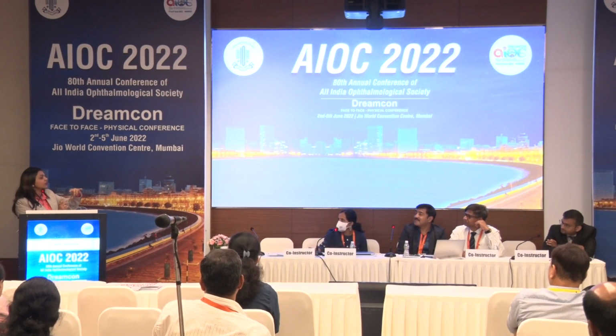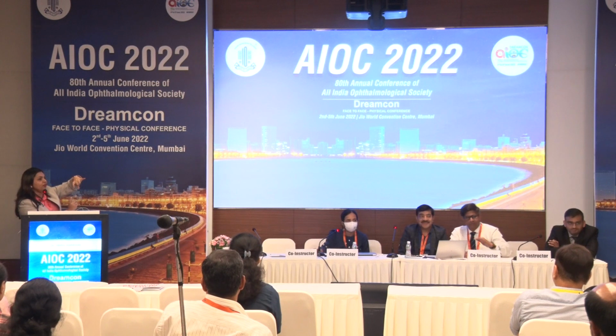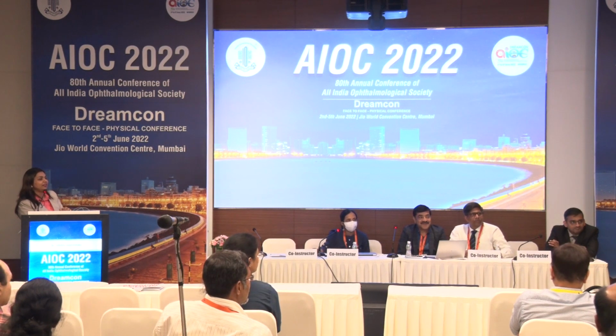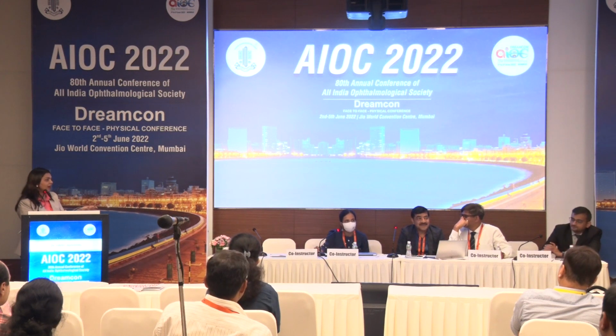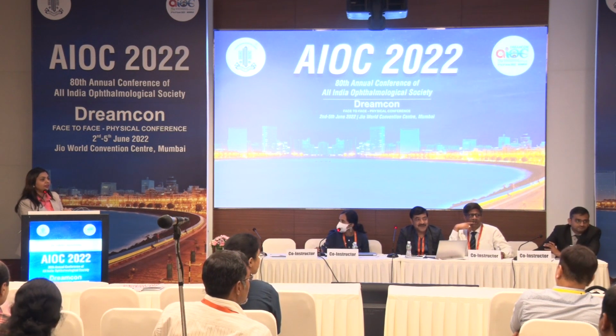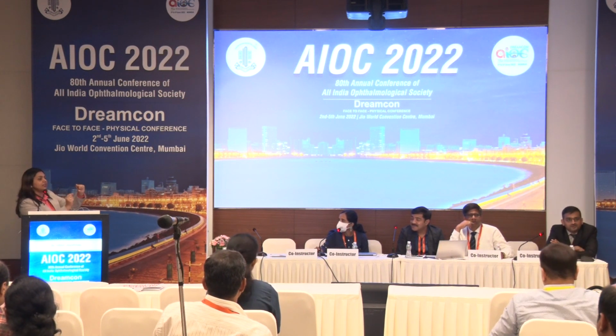And for the people who want to steady their hands, you can just put one finger on the forehead of the patient and then stabilize the camera and take it. Only 6 o'clock? No, the 180 side. We can mark anywhere, we need not even mark, we can consider any iris vessel or any scleral vessels for that, and just assume it to be the mark instead of manually marking it. Then you compare with the data from the Verion.